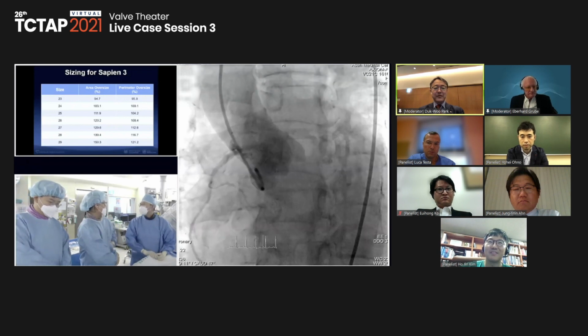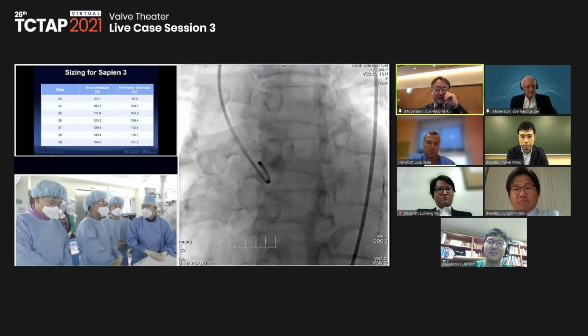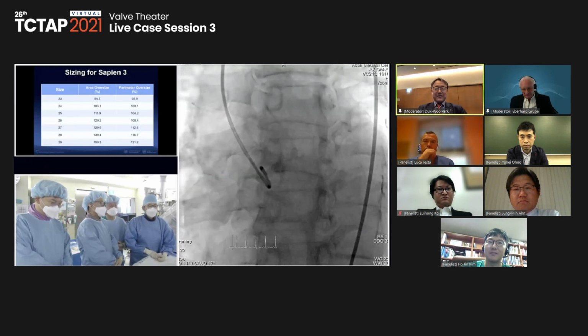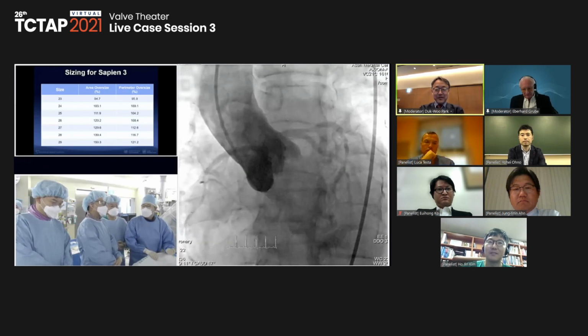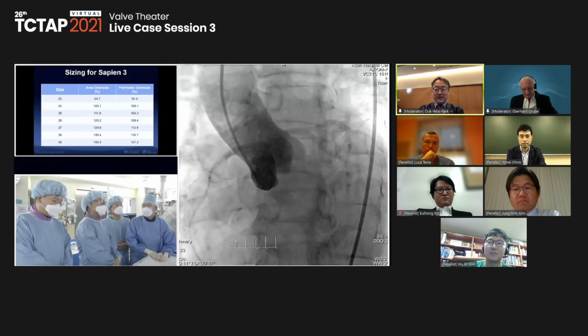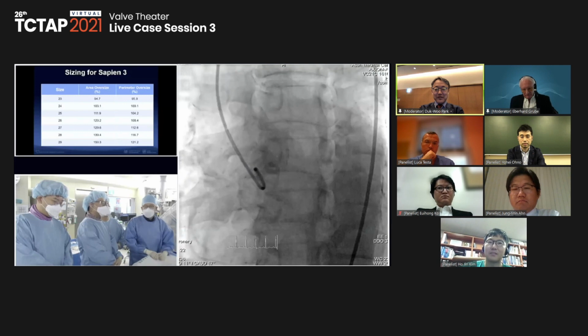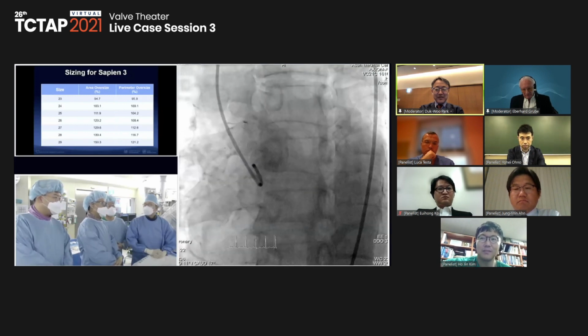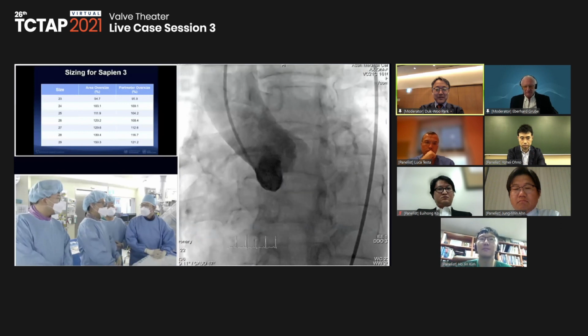about the new updated guideline? Actually, this patient was referred by my senior colleagues from cardiac surgery, and we felt that of course we can operate, but we also agree that TAVI is a good option, and I think this patient is a clear reflection of the new guidelines. Yeah. So 74 is okay, but how do you think about 66?